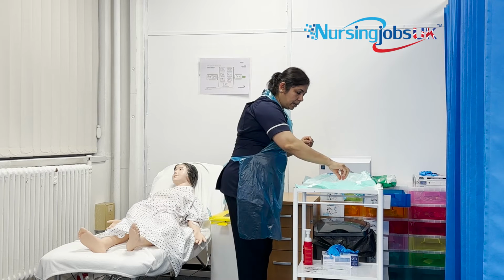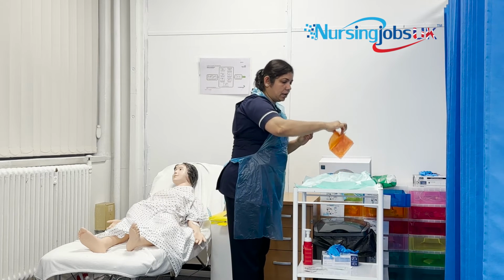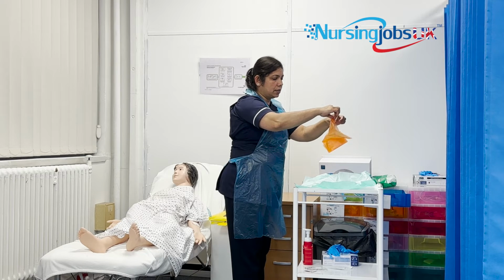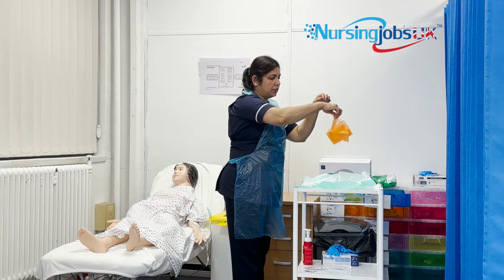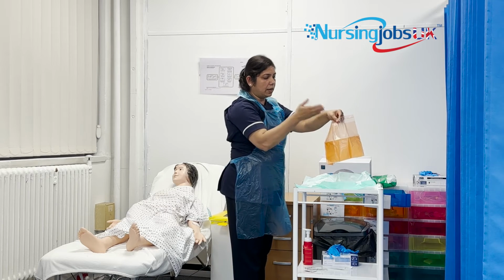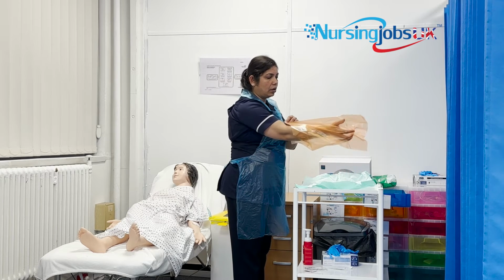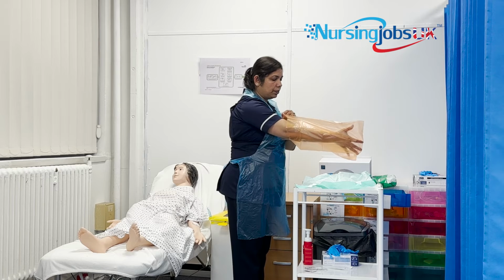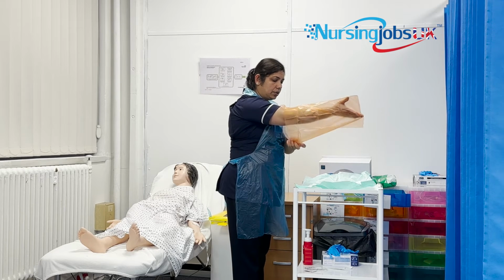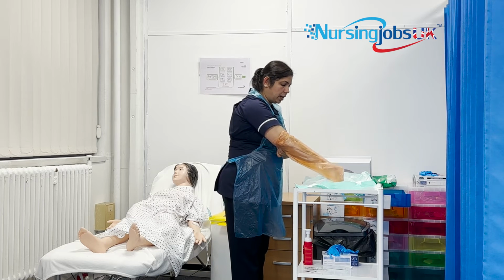So now you can touch only the edge of this orange bag. So you can just touch on the edge one. Now your dominant hand goes inside, and always make sure this should be open just on the dressing bag itself. Try to close like this so that it won't be going anywhere.